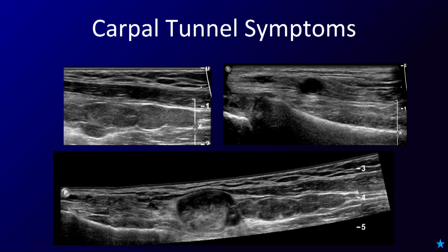They did another MRI of the elbow, which is the next most common location for entrapment, and that was negative as well. So they sent the patient to me, and doing as I always do, I scanned from the wrist and traced the nerve proximally.